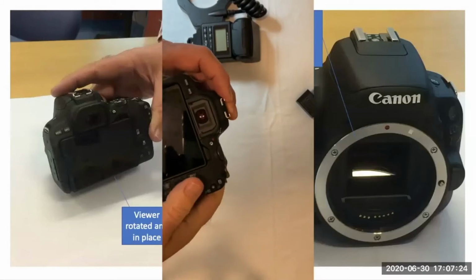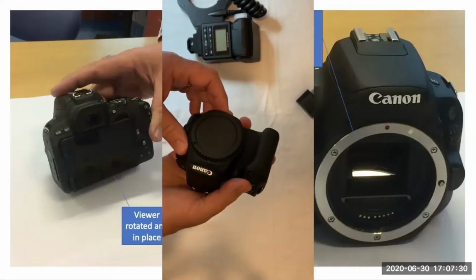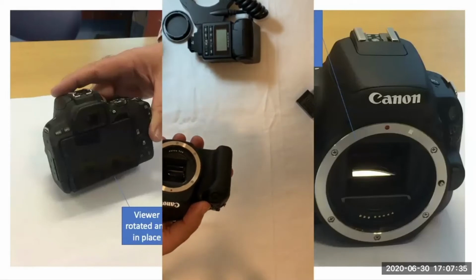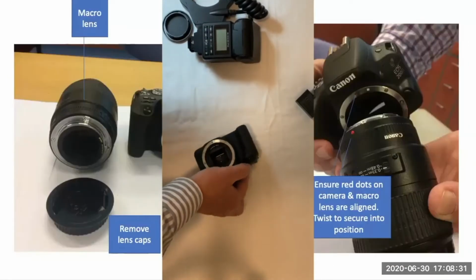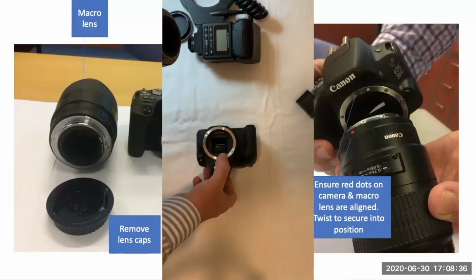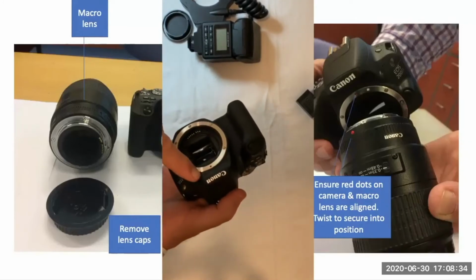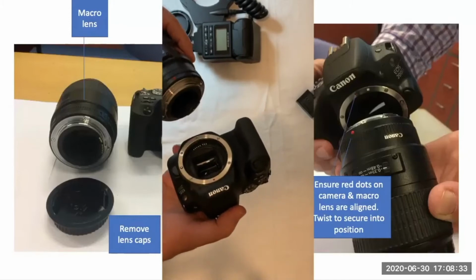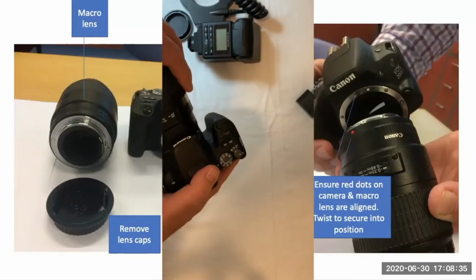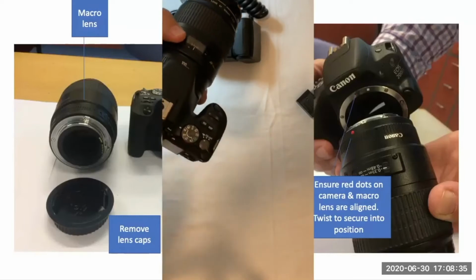Sorry, before we put the battery into the body of the camera, we'll take off the cap that's there. Just twist it around and get the back of your lens. Take off these caps and get the two of them to join up together. The easiest way of doing that is to get the little red dot that is here on the body of the camera and the dot on the lens. Line them up, which they should do, and then twist them around. You should hear a nice click as it comes into place.